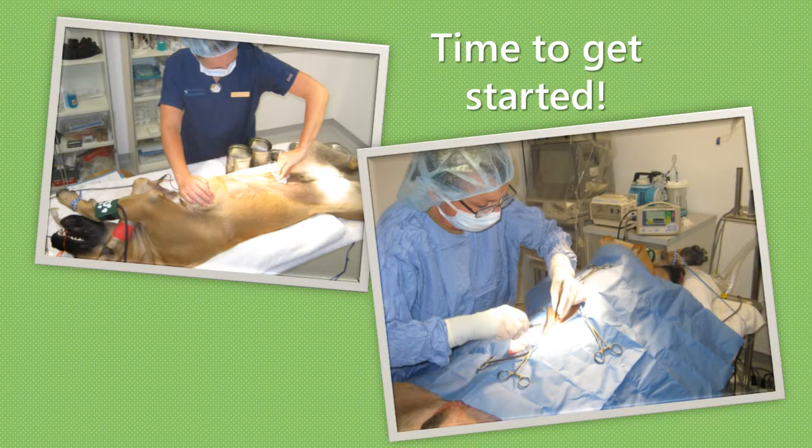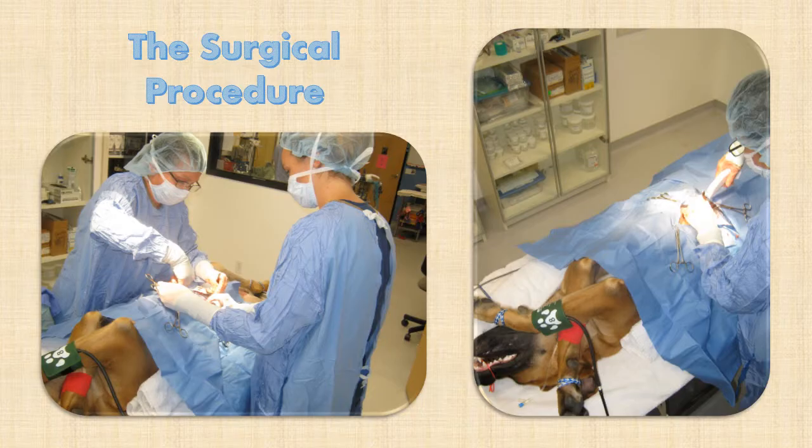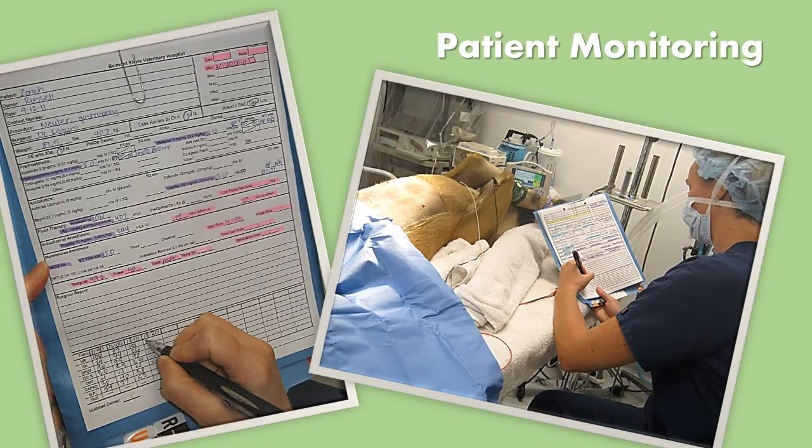The technician performs a final surgical scrub to maintain a sterile area. A sterile field is prepared by draping the patient prior to the first incision. If assistance is required, a technician will gown up in the same sterile manner as the doctor. At the end of the surgery, the doctor will close the incision with sutures or staples. The doctor assigns a team of technicians for each surgery, making sure the patient is monitored at all times. Using a team approach increases patient safety during surgery.